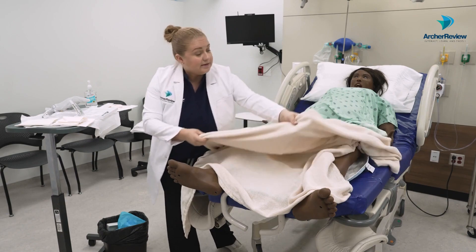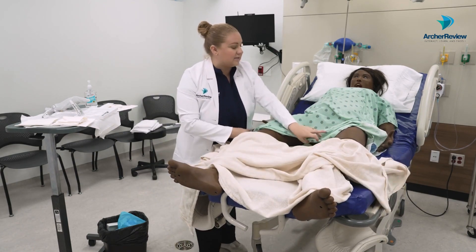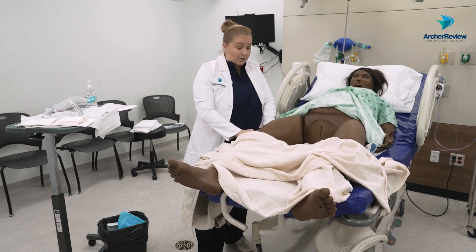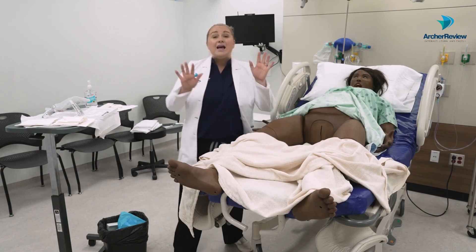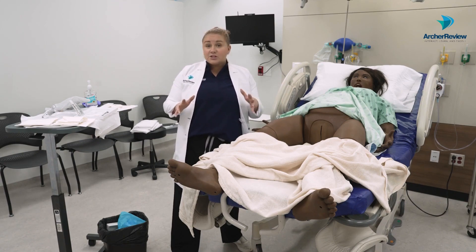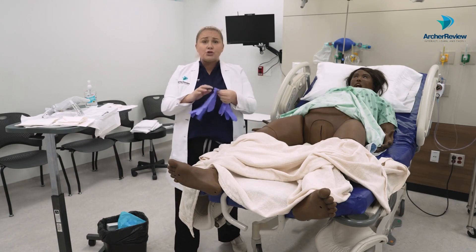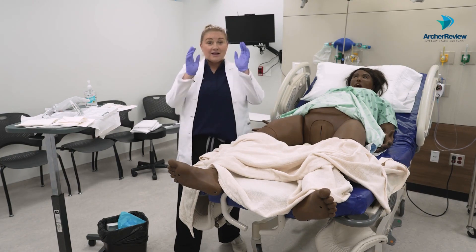I like to move the blanket down just to the length that it needs to — we're going to keep her as modest as possible. Lift that gown up, and then we're going to prepare this area. We are already on a chucks pad in case we make a mess. At this point, to do the draping, I've washed my hands, so I'll go ahead and put on clean gloves so I can get everything situated before I go sterile.